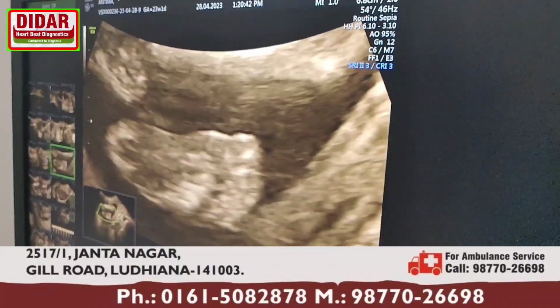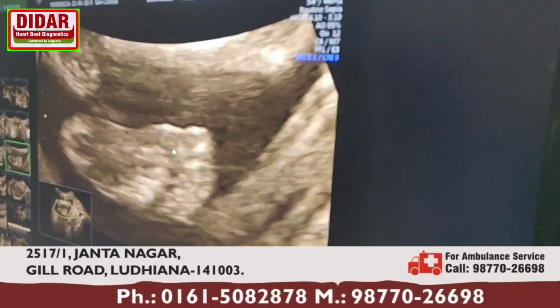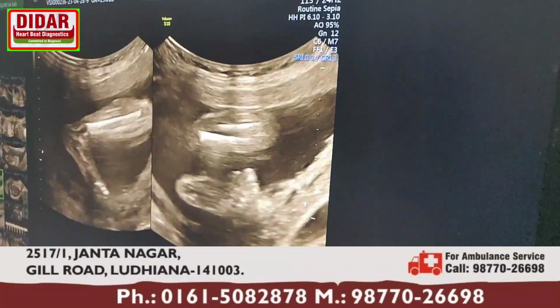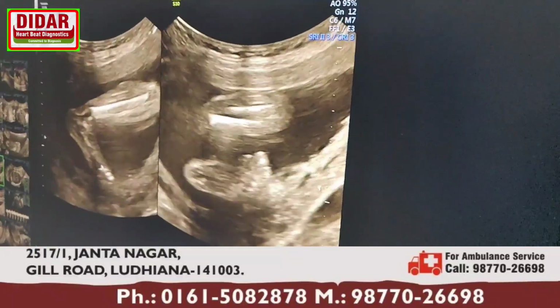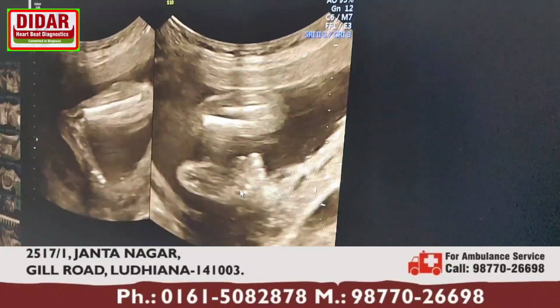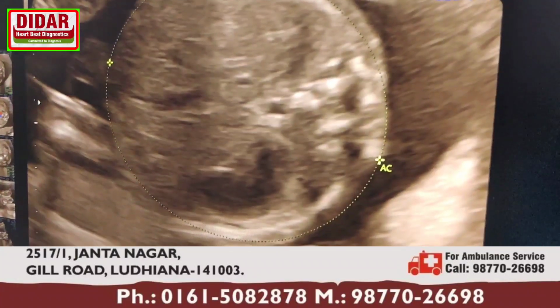See this beautiful image of the baby's foot. And in the next image, I have taken both the lower limbs. This is the foot with the leg, and this is another foot. And then the stomach I have already shown.